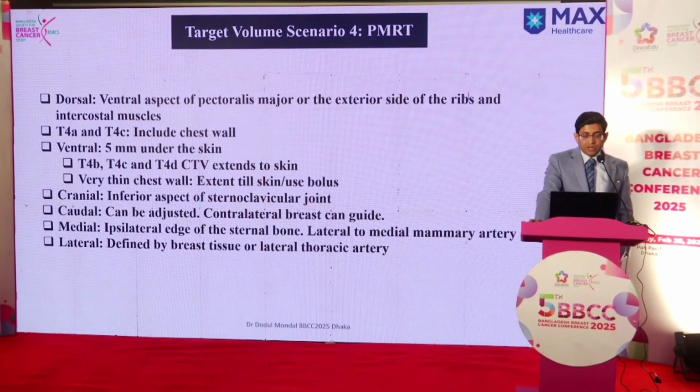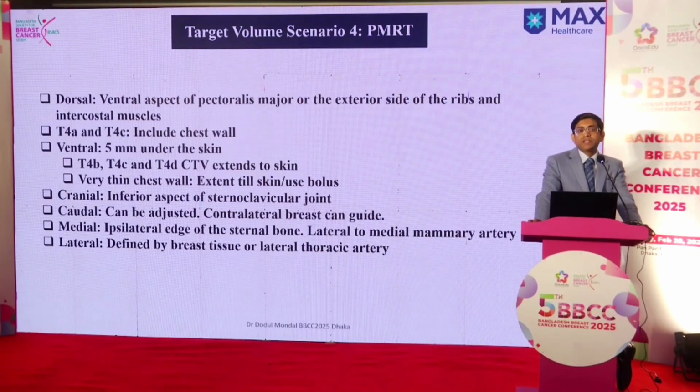For a very thin chest wall, we have to extend this CTV to the skin, because whenever you edit it off by 5 mm, many times it actually spares the chest wall from being treated. So be sure that the chest wall is not very thin, and that editing off by 5 mm from the skin is not excluding the actual CTV from the contouring.